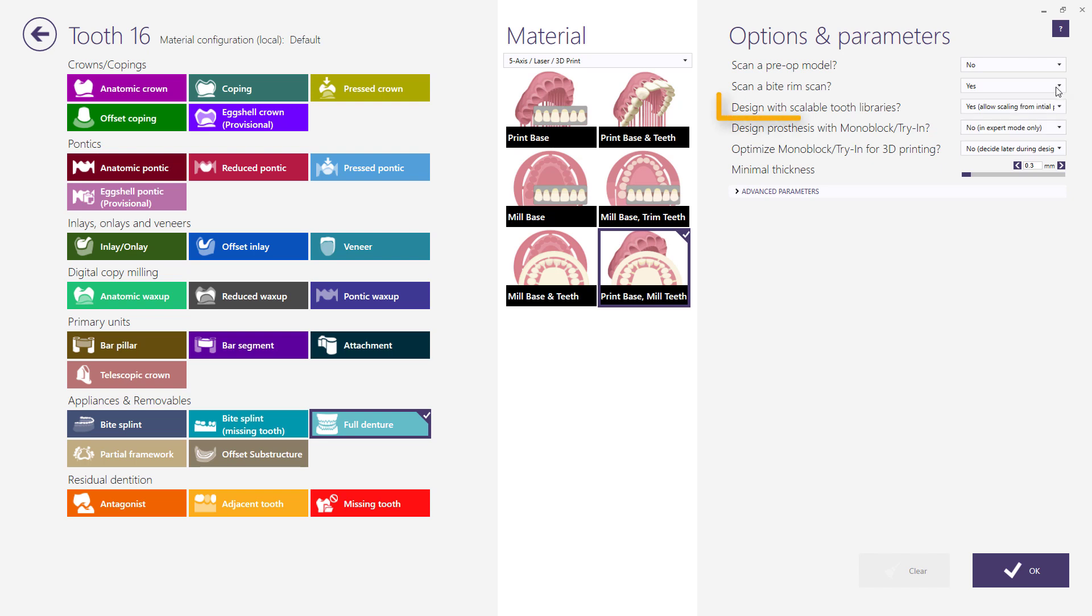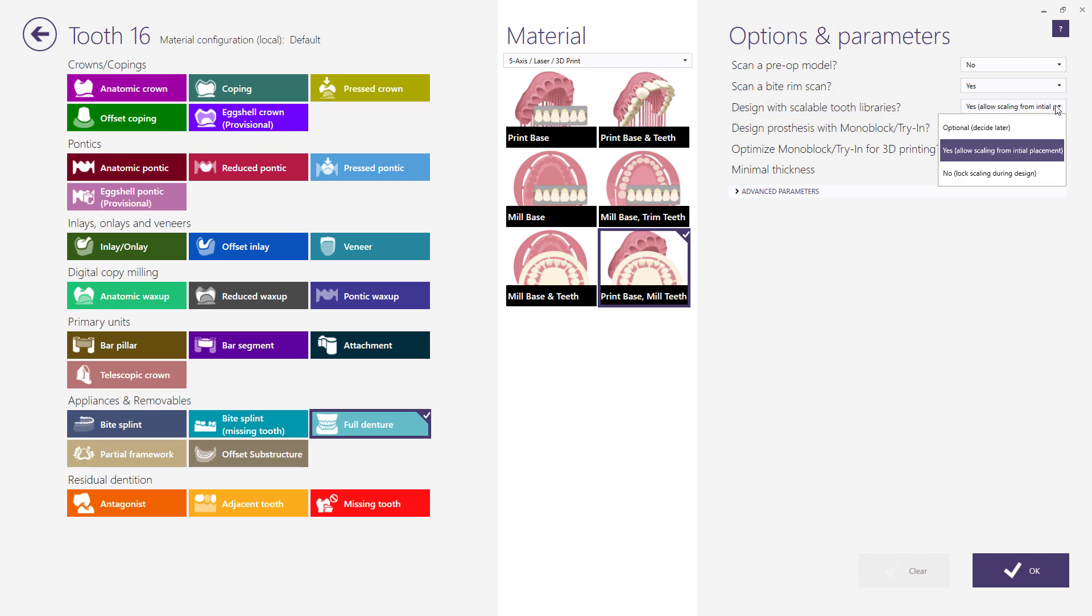You can design with scalable tooth libraries which can be locked or unlocked during the design. Denture bases with teeth to be milled or printed are set by default to yes allow scaling from initial placement. And denture materials with stock denture teeth are set by default to no lock scaling during the design.